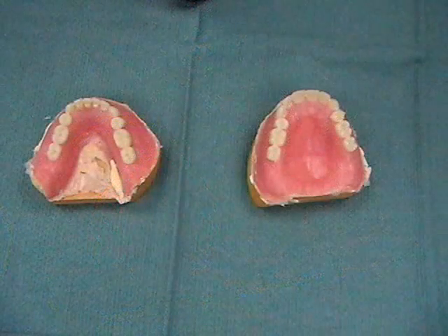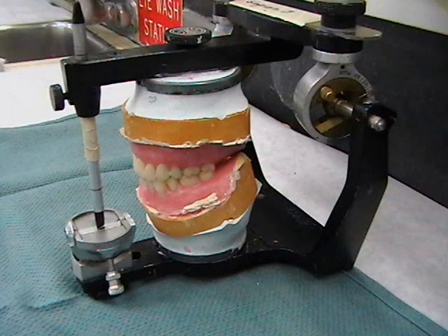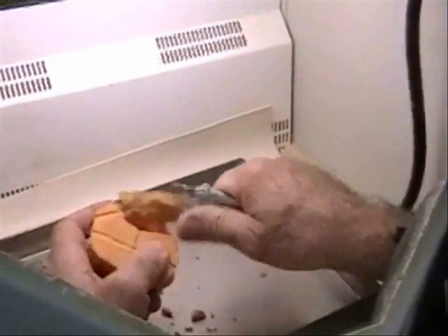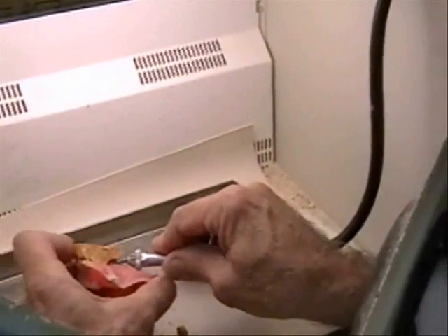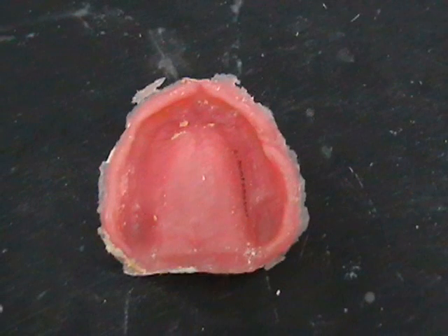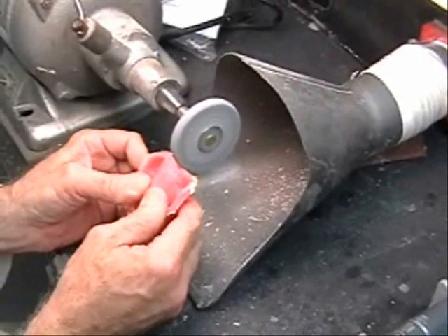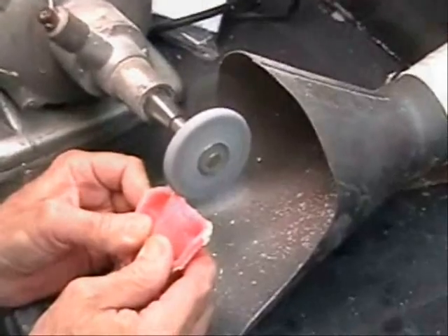The dentures are returned to the articulator to correct for any laboratory processing errors. A thin layer of acrylic resin flash formed by the land area can be seen. The flash acts as an important guide for the technician to preserve the denture border created in the final impression and subsequent master casts.